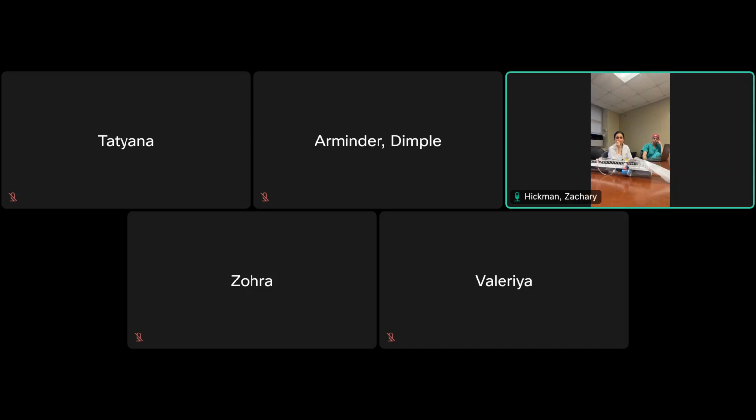Does anybody know the main risks of placing an EVD? What are the negative consequences of doing an EVD? There are two big ones, and there are other ones that pass on. Malposition. Yeah.